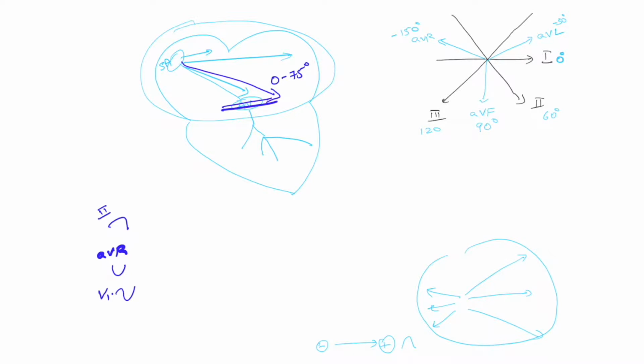So, because of the slowdown at the AV node, you would see a flat line, and following that, the wave travels through the bundle of His, and then through the septal fasciculus, and here the wave of depolarization goes to the interventricular septum, which depolarizes from the left.